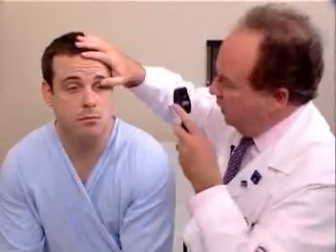We repeat the same procedure on the left eye using your left eye and holding the equipment in your left hand. And again, I'm about 15 to 20 degrees off of midline, and keep looking in the distance. And as one gets closer to the patient, the diopter wheel focuses first, as we go through the cornea, the lens, the vitreous, and now the retina. The optic disc is well visualized, as is the vasculature.